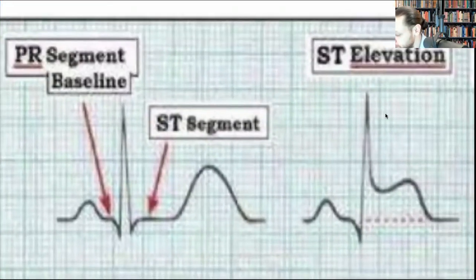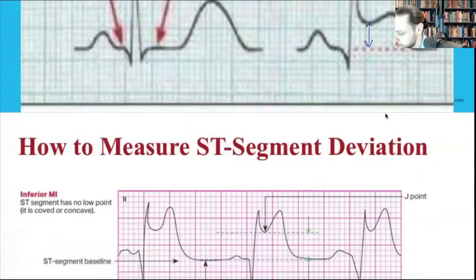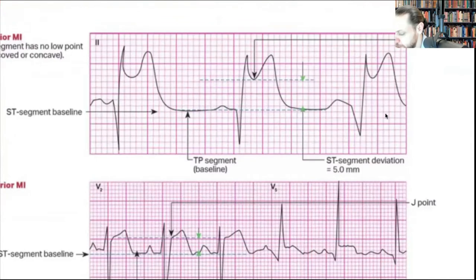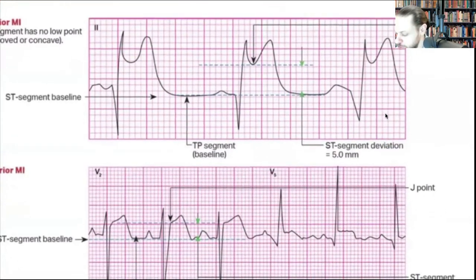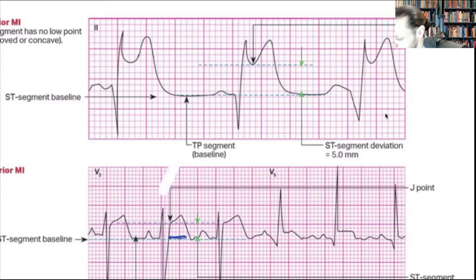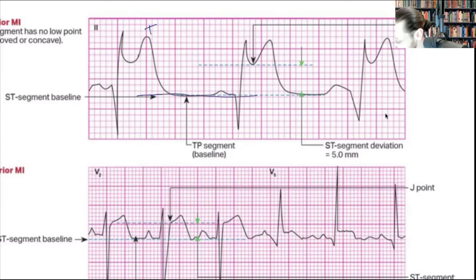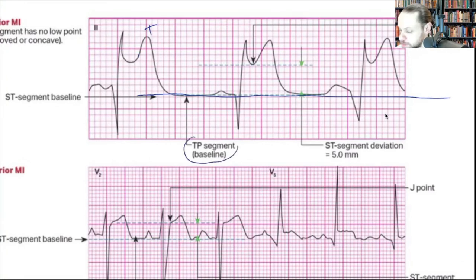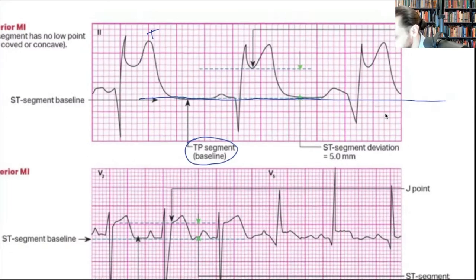This is the ST segment and this is what we measure. Very important: I'm not looking at the ST segment first. First I want to find the T wave and the P wave — because I want to find the TP segment. From T to P is my baseline. Once I draw that line I know the baseline of my EKG. You must find the TP segment first, or you'll mess it up.